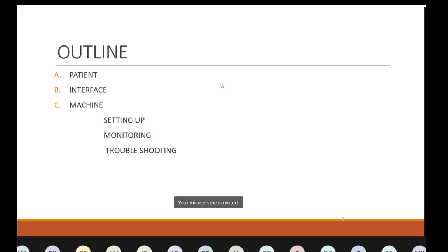oxygen. If the oxygenation of your patient is not improving with a BiPAP machine, it is because the FiO2 is not adequate. So what you should do, if you are not planning to intubate the patient, is shift the patient from a BiPAP machine to a ventilator NIV, so that your patient is getting an FiO2 of 100%. And the advantages are, you have alarms and you have a double limb circuit. These are the other advantages of an adult critical care ventilator.